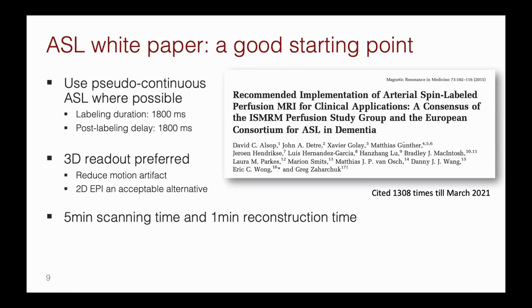But it's worth noting that these recommendations were aimed at clinical applications. So it aims for something that is simple and widely available, but not necessarily trying to say what is the best. But it's a good place to start when we design our studies. And actually, in the studies that I'm going to show you today, we have chosen this recommended ASL, or the standard ASL technique, as the benchmark for our comparison.